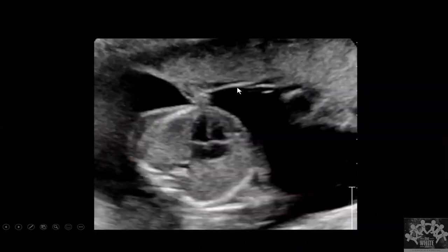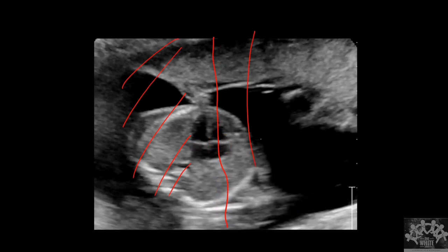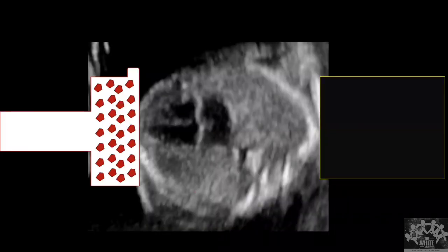Now what I want is to see how the mitral valve moves, how the tricuspid valve moves. So I don't want to image the rest of the things. I just want only this level. Instead of stimulating all these things and getting the reflections back, I get the sound only from this level, whichever level I want. So I keep the probe at the level of the moving structure I want to see.